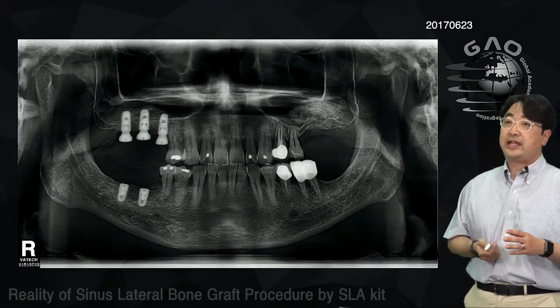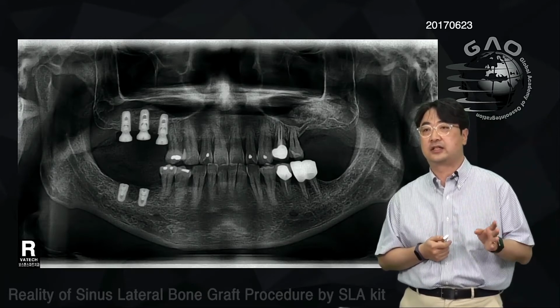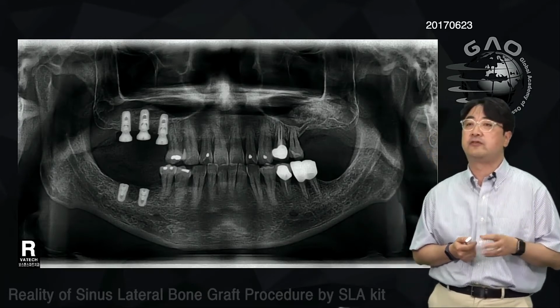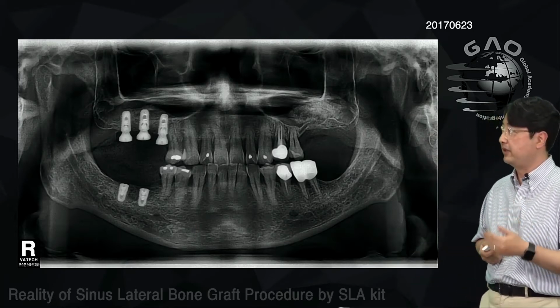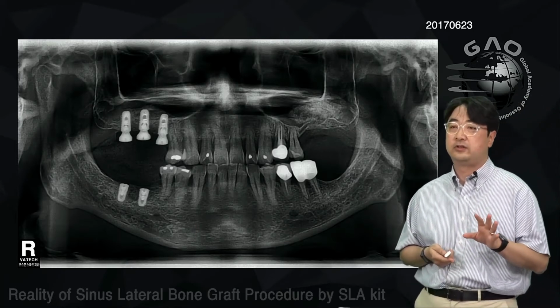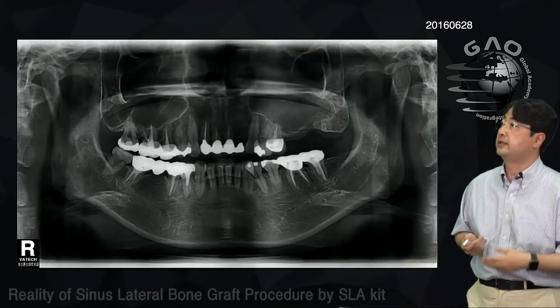Okay, so with the SLA kit, you can do most sinus grafts like this. You have to be familiar with using the Freer elevator and the LS reamers. By the way, you're going to get used to it, right? Then you can do the sinus graft without stress, right? Okay, so here is another case.